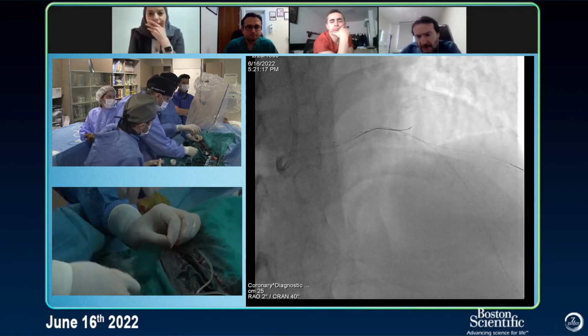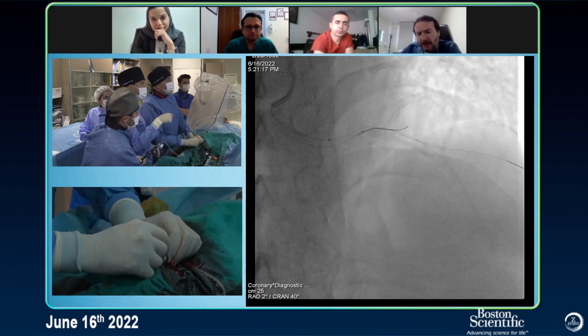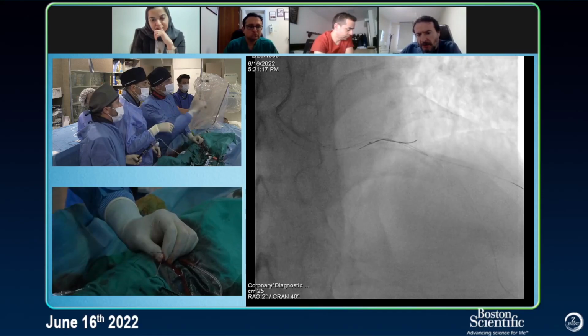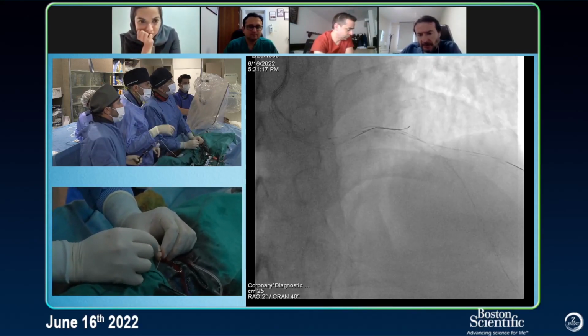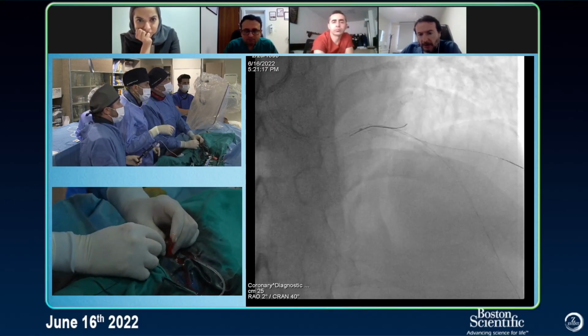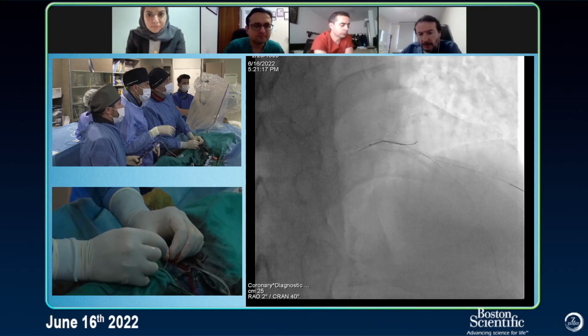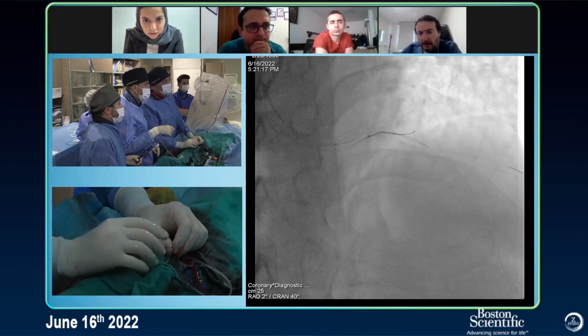Which is the stent? The stent is here. Can you retrieve the first diagonal wire? It will help you. No, I mean, now my issue is pulling the stent into the guiding. Oh, you can't do that now. Because I have an issue. Yes, okay. You see? Yeah.